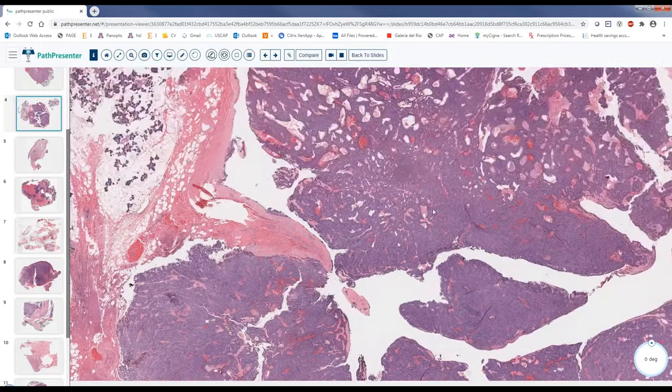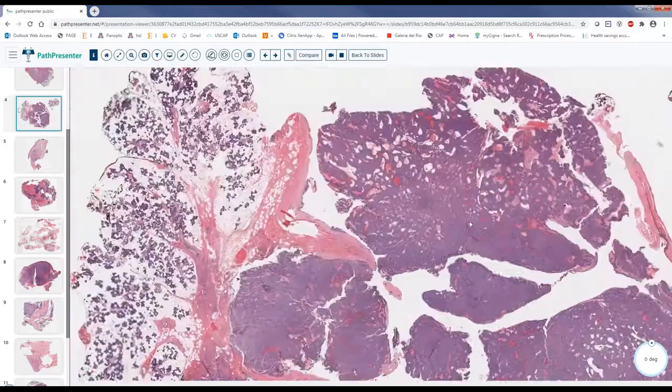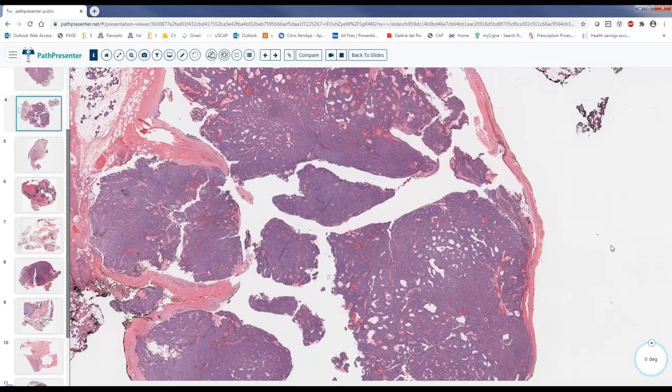I would agree with you, most of the time it is basal cell adenoma, and to call it basal cell carcinoma, you need to prove that. It's not an easy thing. How many sections are needed to exclude this? Well, I would like to at least get the entire capsule. If it is huge, first of all, you have to be worried.